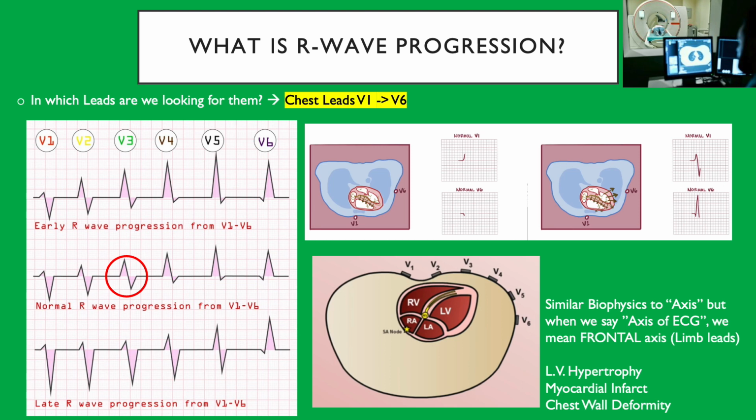Just a little note, where is the left side, here or here? Do you know how to look at the CT images, MRI images? Yes. So basically, when you put them inside, the patient looks like this, his legs look towards you. So when the image comes, this is the left side of the patient. Okay, you always look from the legs upwards.